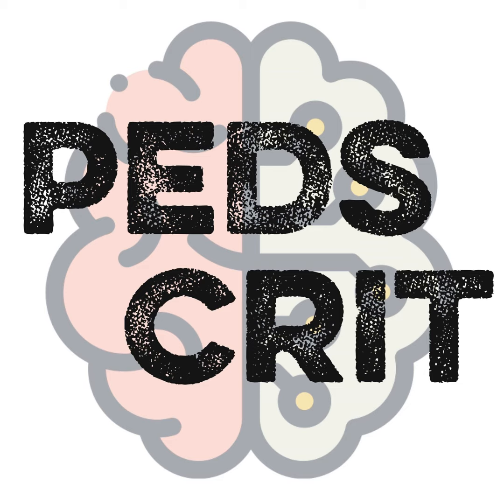And that's where you trap the clots. The oxygenator is considered one of the main sources of clots that can propagate and put you at risk for stroke. So in a VAD, you don't have an oxygenator, right? Eliminating the oxygenator, which is an important risk factor for stroke, is one of the other advantages.